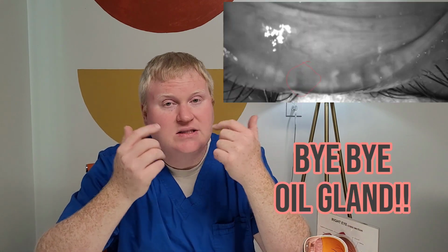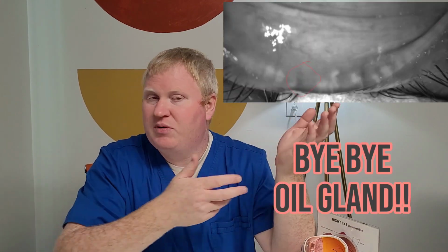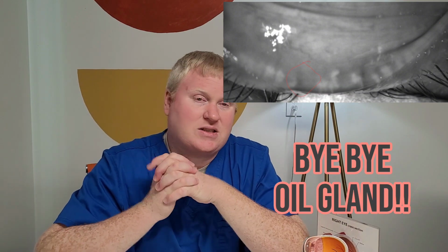The procedure, depending on how plugged your oil glands are, keep in mind you have 20 or 25-ish oil glands in each eyelid. So we've got about 100 of these oil glands that we need to work on, and that can take some time, typically 5 to 10 minutes at least. Some of the oil glands, we may not be able to get open. Some patients have already lost some of their oil glands, and of course, trying to open up an oil gland that no longer exists because it's died off from years of not being treated obviously doesn't work very well.